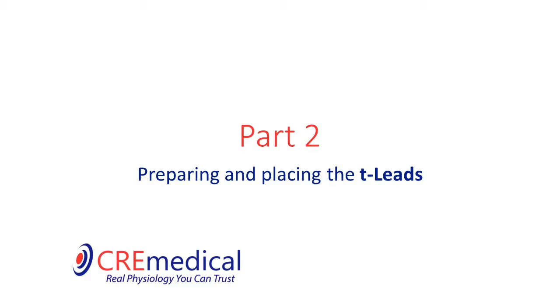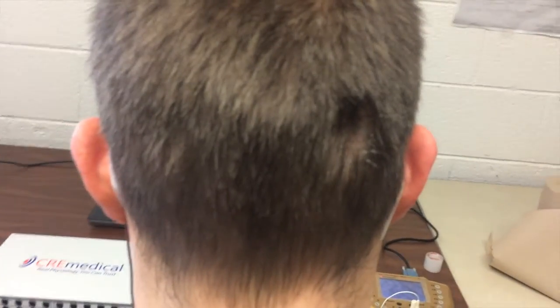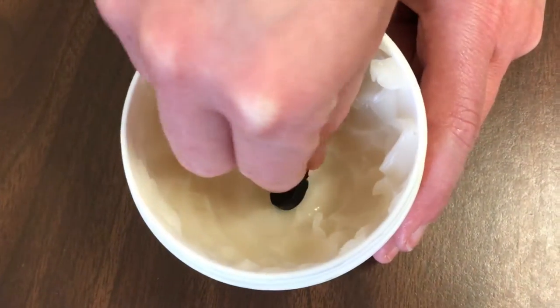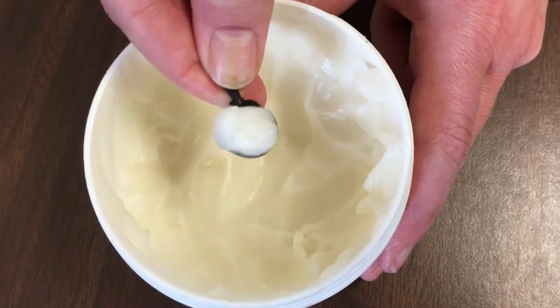Part 2. Preparing and placing the T-leads. Prepare the subject's scalp as you normally would when placing conventional disc electrodes. We apply 2 to 3 millimeters thick of Ten20 paste or Elefix on the TCRE prior to placing the T-lead on the scalp.